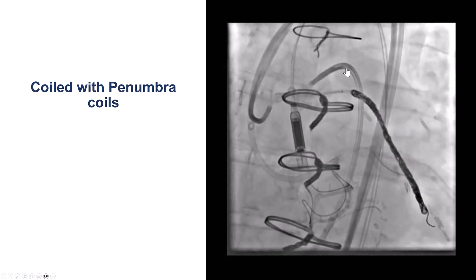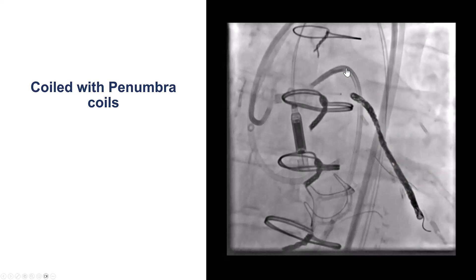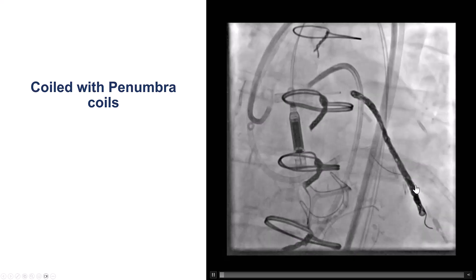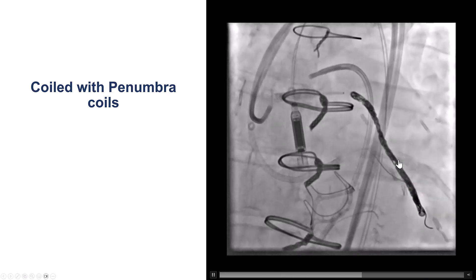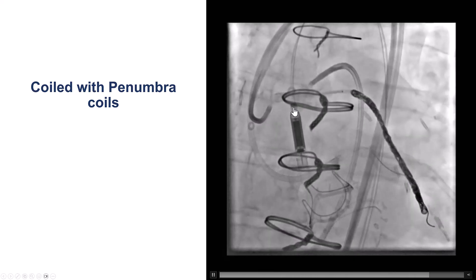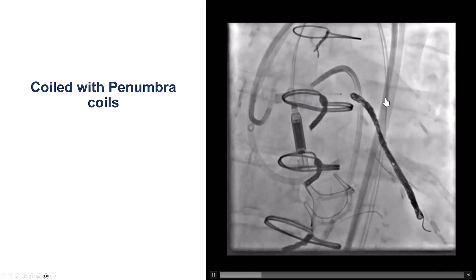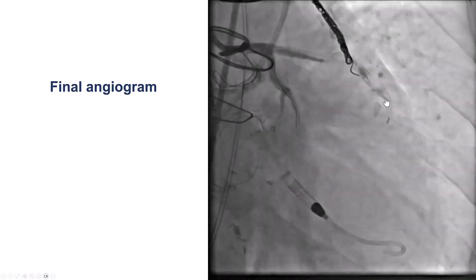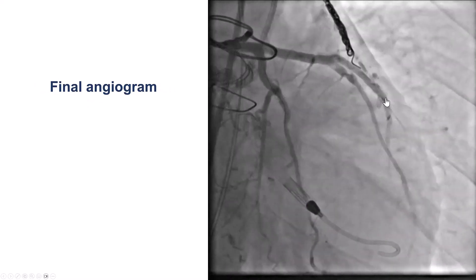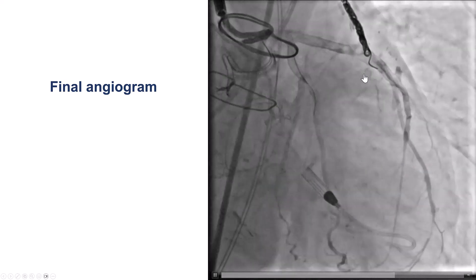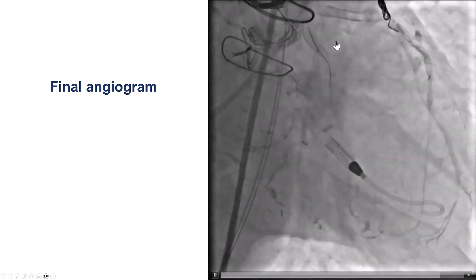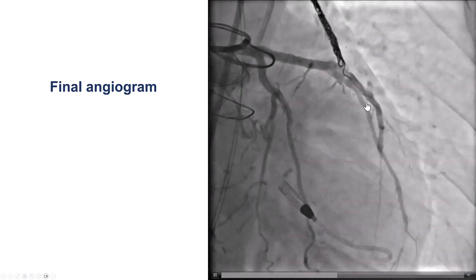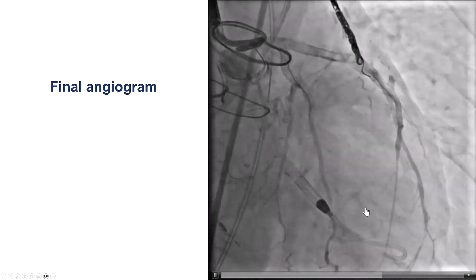We placed several Penumbra coils — a POD coil distally and then a packing coil more proximally — which successfully occluded the vessel. This was the final result: we no longer have any competitive flow, and we see excellent filling of the LAD as well as the diagonal branch.